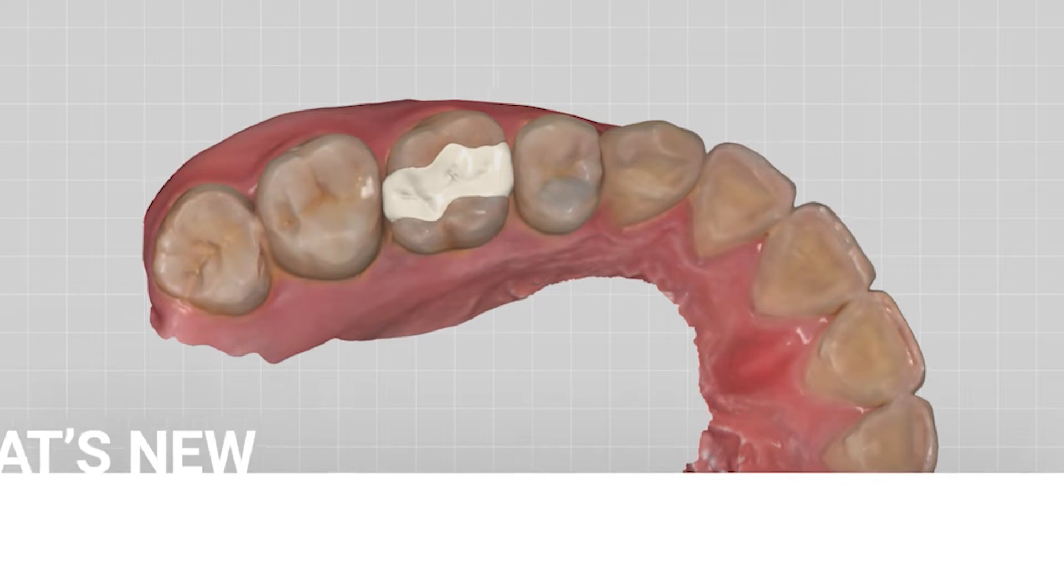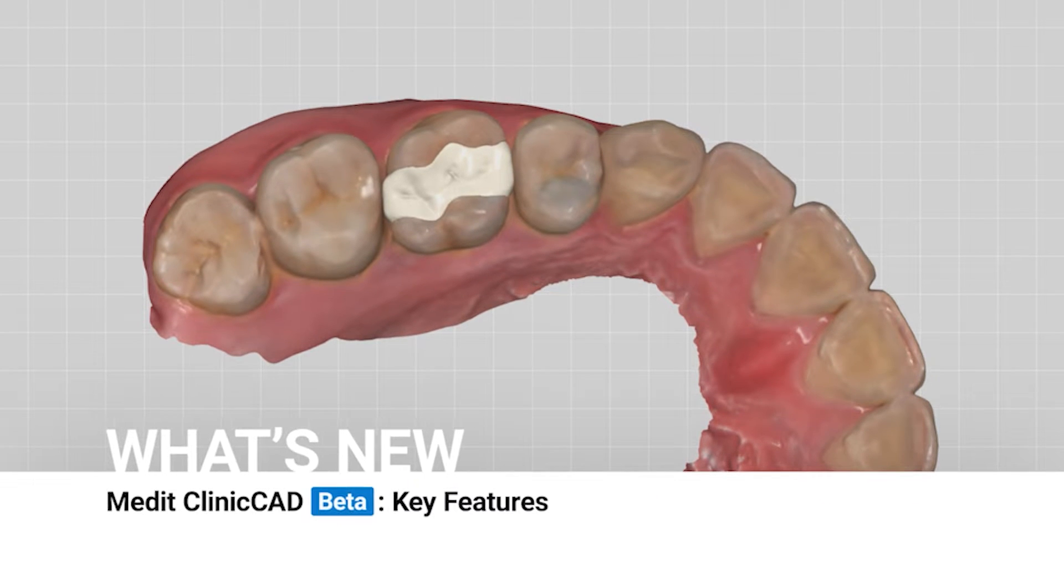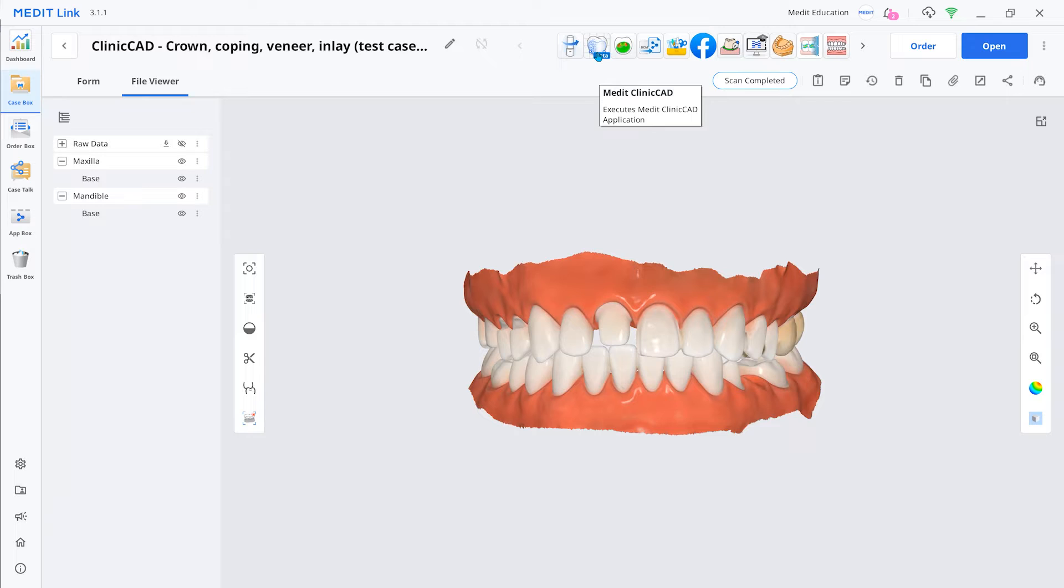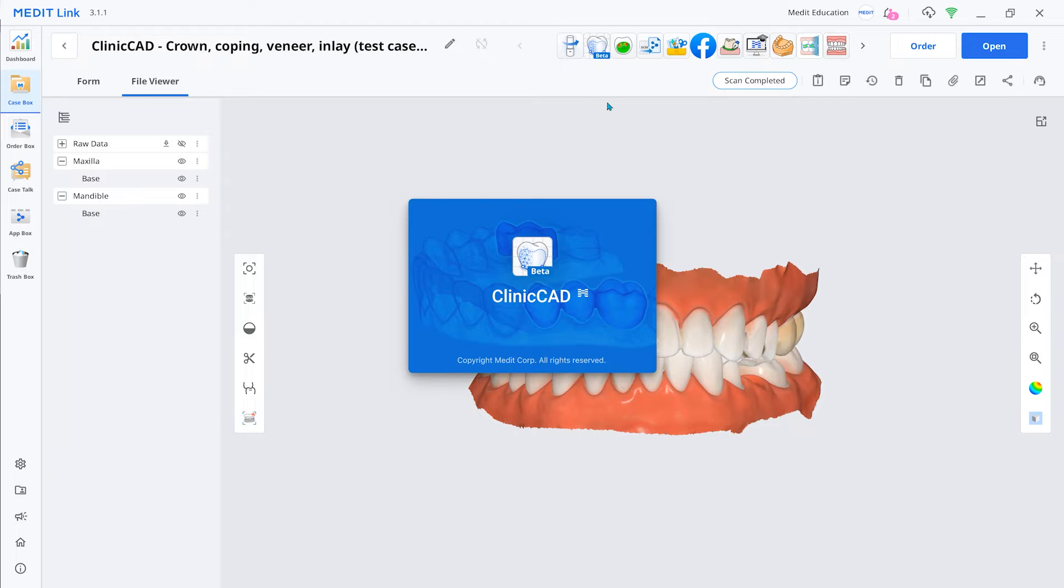You can design various prostheses with the Medit ClinicCAD. Let me introduce the new features in Medit ClinicCAD. This video was created based on the beta version of Medit ClinicCAD, which will be released soon.